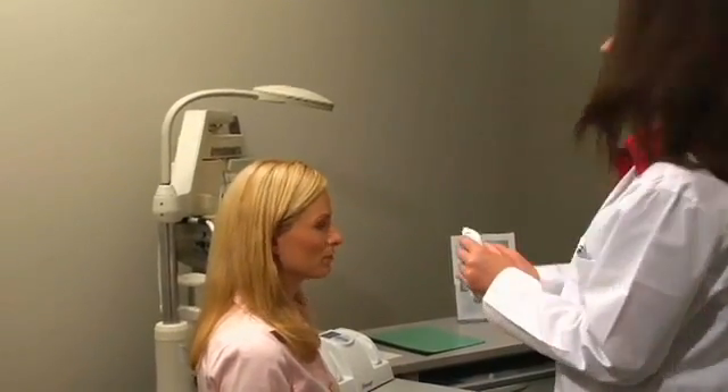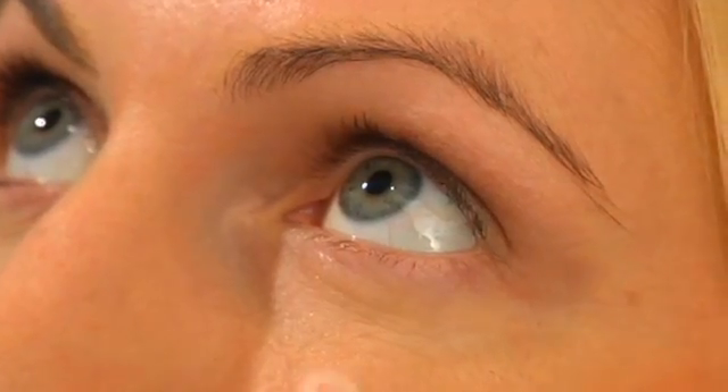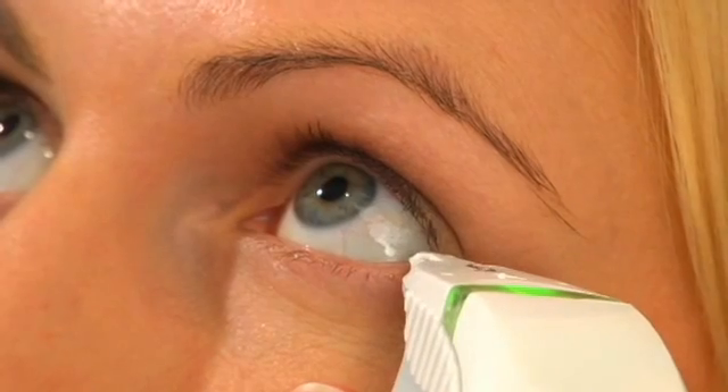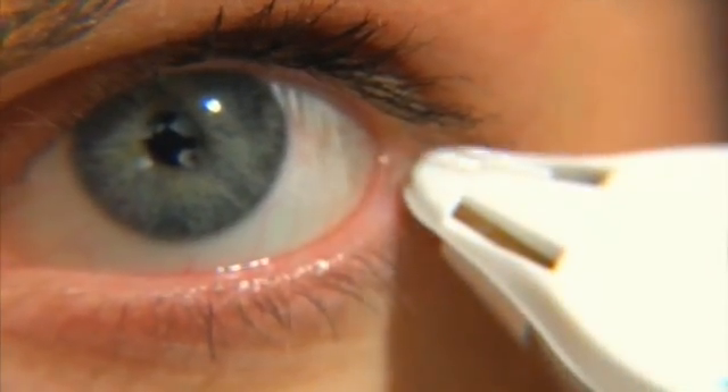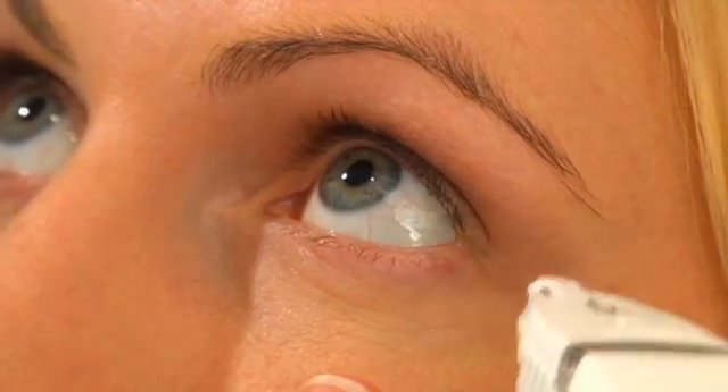If tears are not collected immediately, do not pull away from the eye. Leaving the test card in contact with the eyelid, lightly brush the pen back and forth along the outer one-third of the lid, avoiding the cornea.